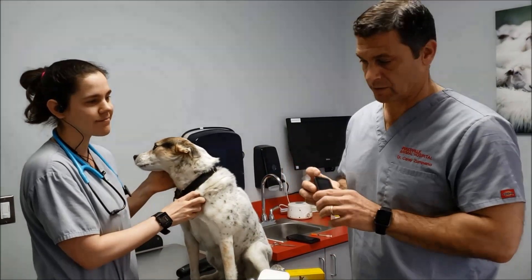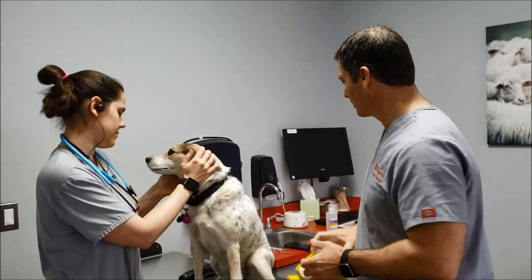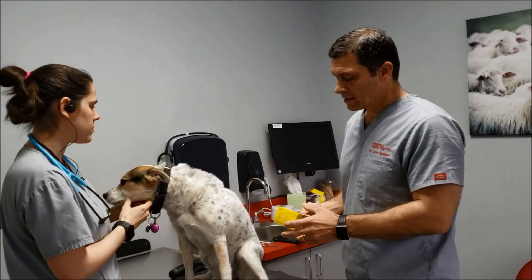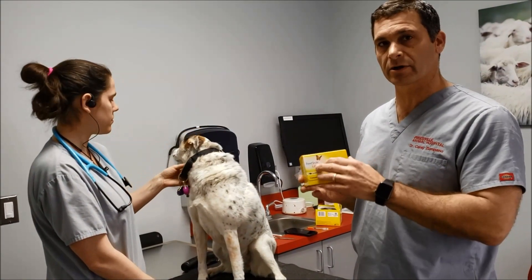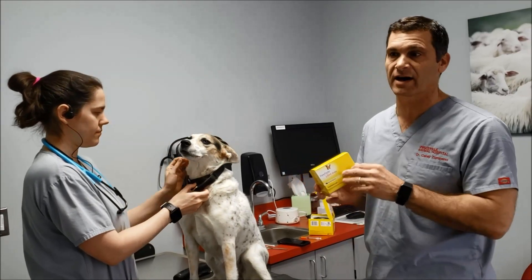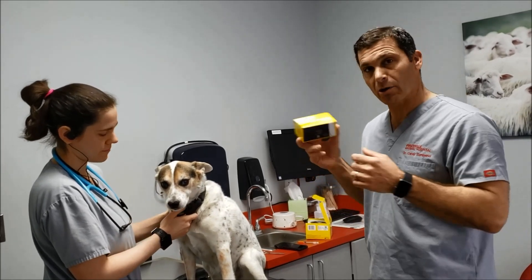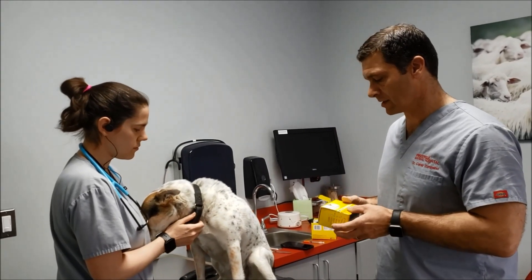We actually have one of these that we rent out to our clients, and you can buy one yourself. The cost of this reader is about 65 to 100 dollars — we got this one for 65, so we're excited. This unit, which measures sugars for two weeks, usually runs about 35 to 65 dollars. The standard retail price seems to be about 65 at pharmacies, but if you look for a coupon online you can often get it cheaper — we got ours for 35 dollars.